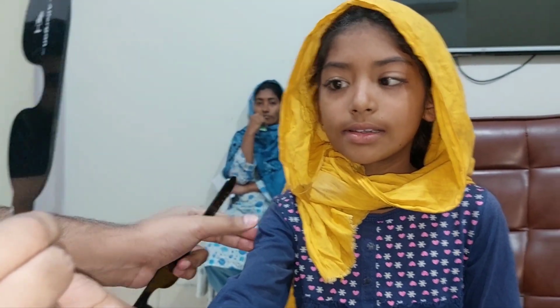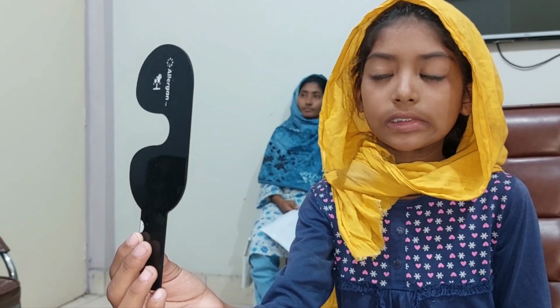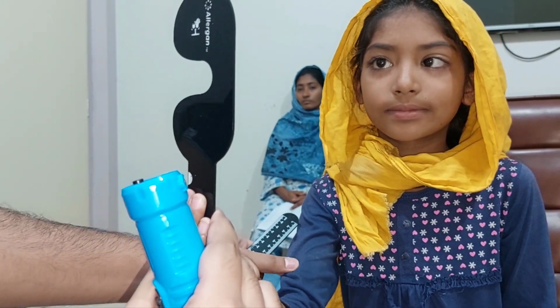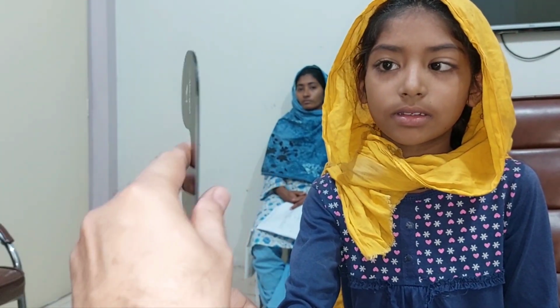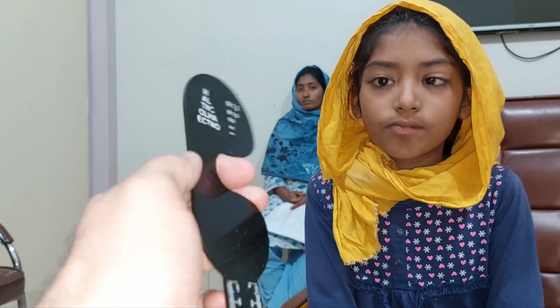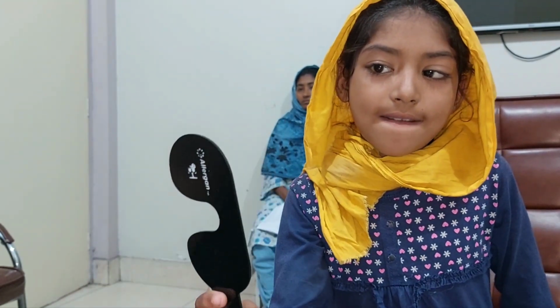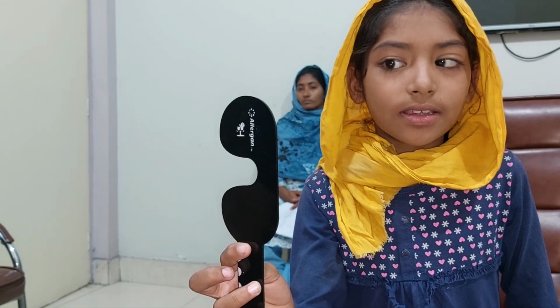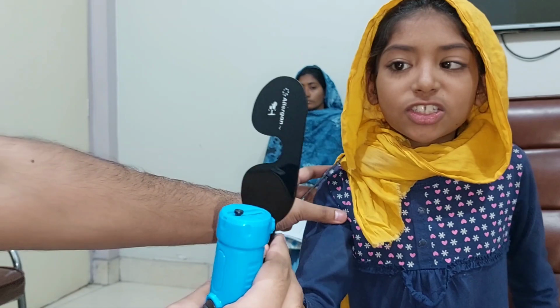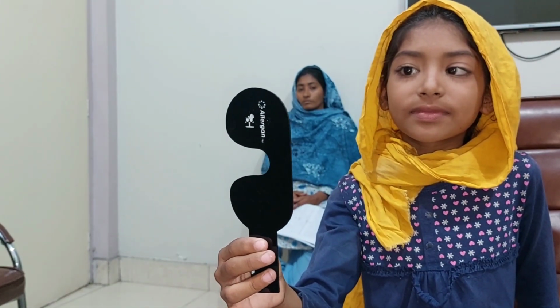Should I keep this arm distance or a half arm distance? There is no strict policy. The patient should be fixing at the near target, which is accommodative. See, this target is good. It has a miniature Snellen chart so that the patient can read. Can you read ABC? Come on, read this ABC. So when the patient fixes at the target and describes the details or reads the chart, it means the patient is focusing, fixating.